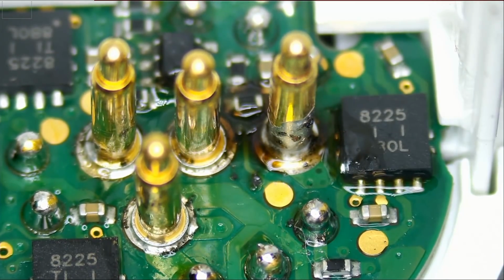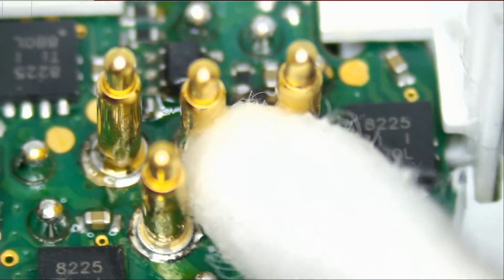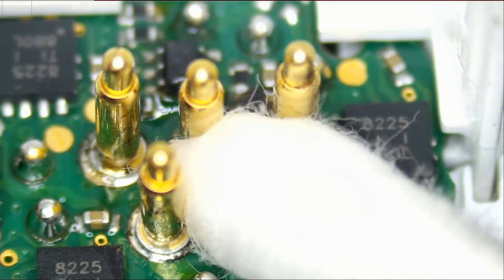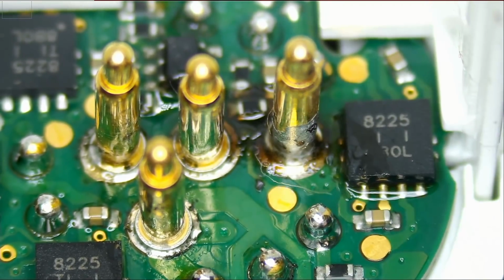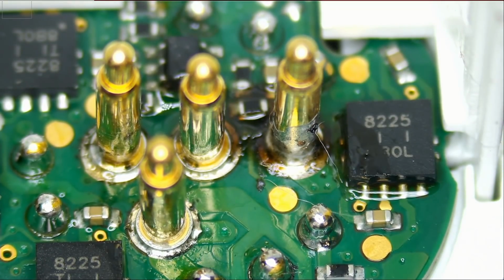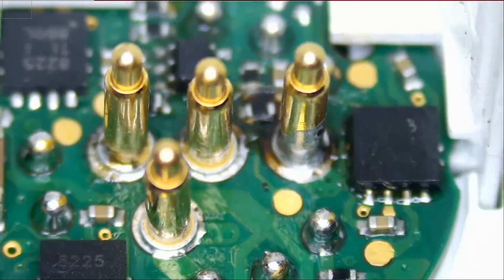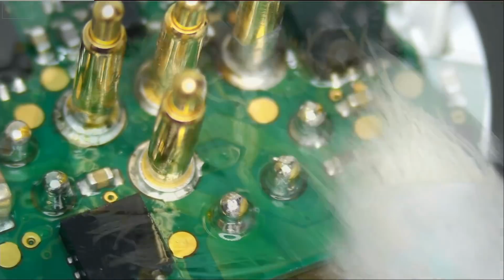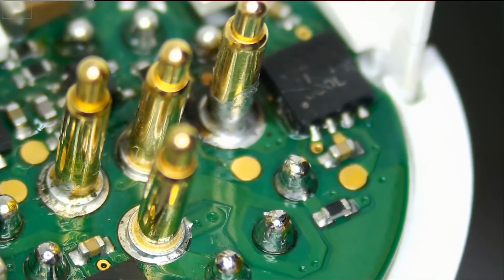And we have another medical device that came in today. I think it's an X-ray sensor cable. It's damaged, and medical stuff are expensive. In most cases, you cannot replace the part. You have to fix it. Job is done.